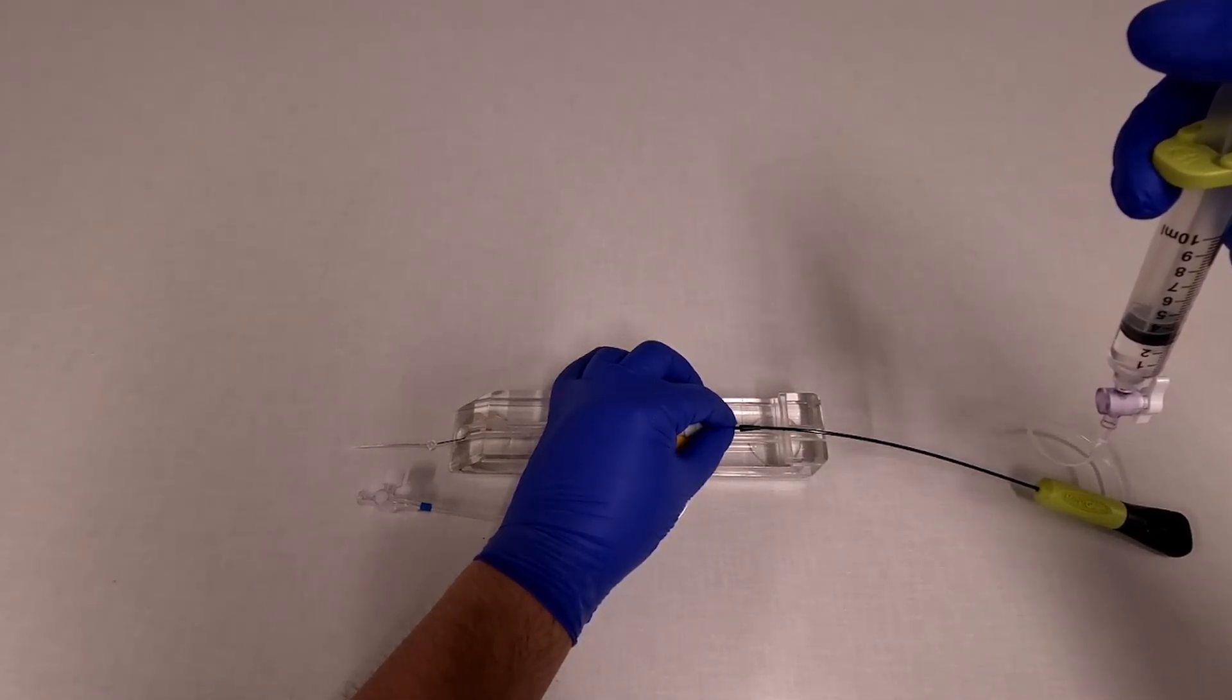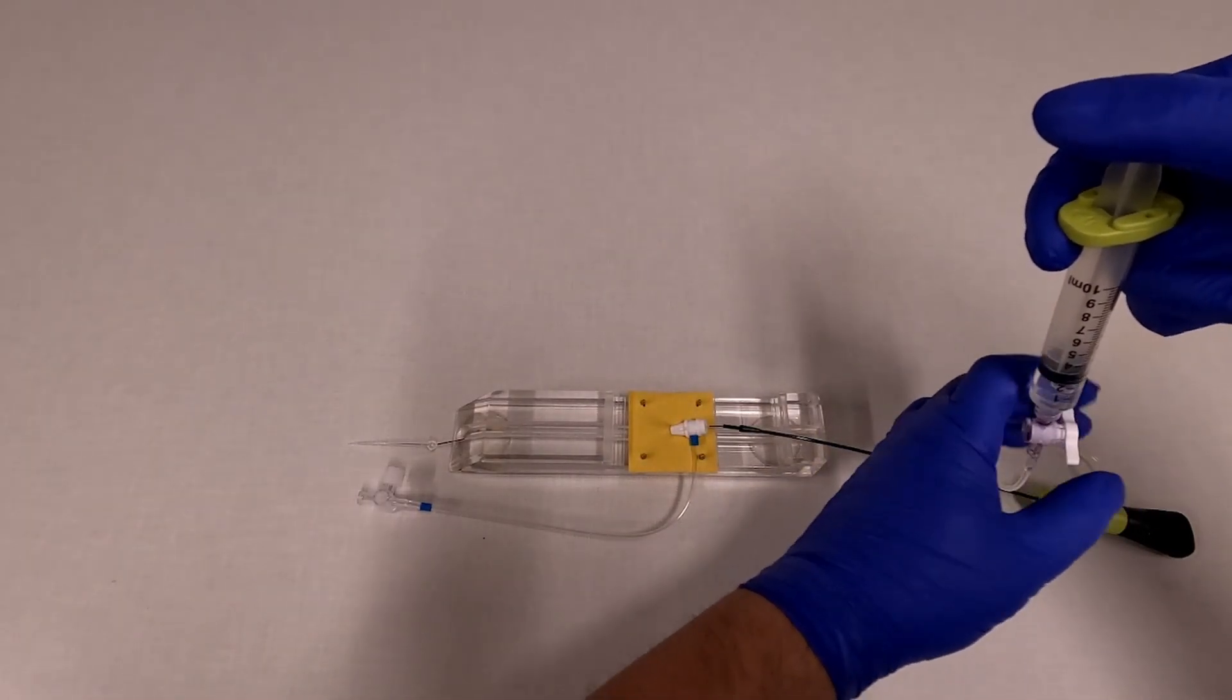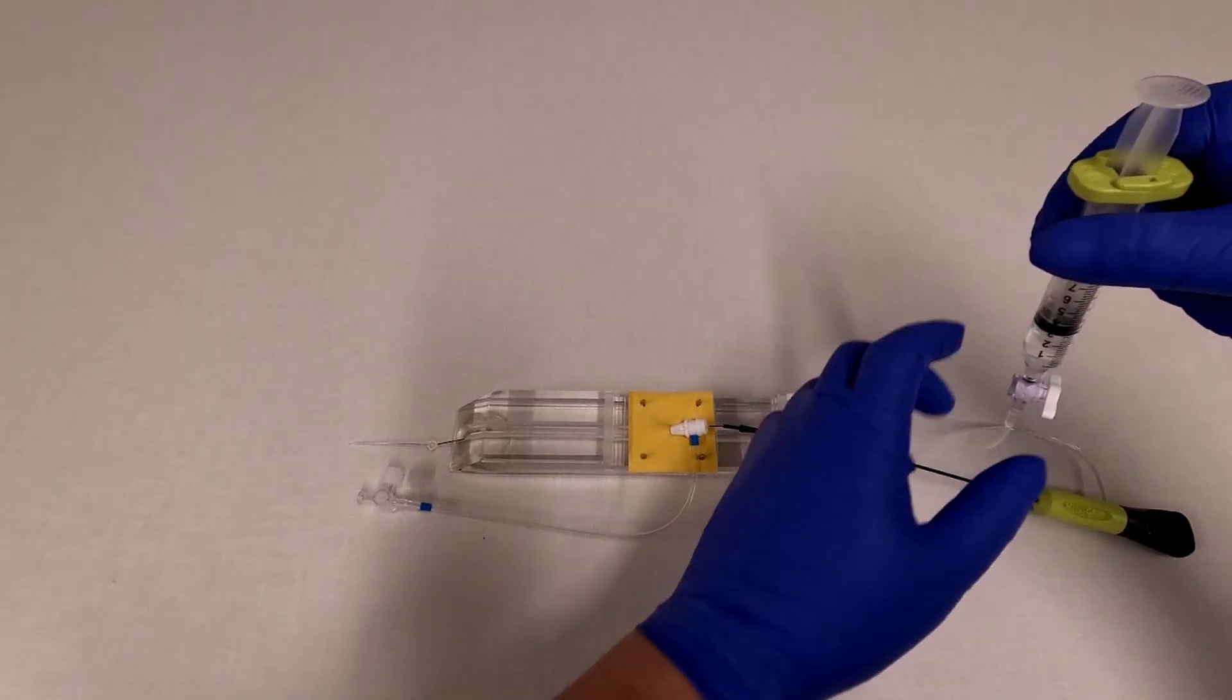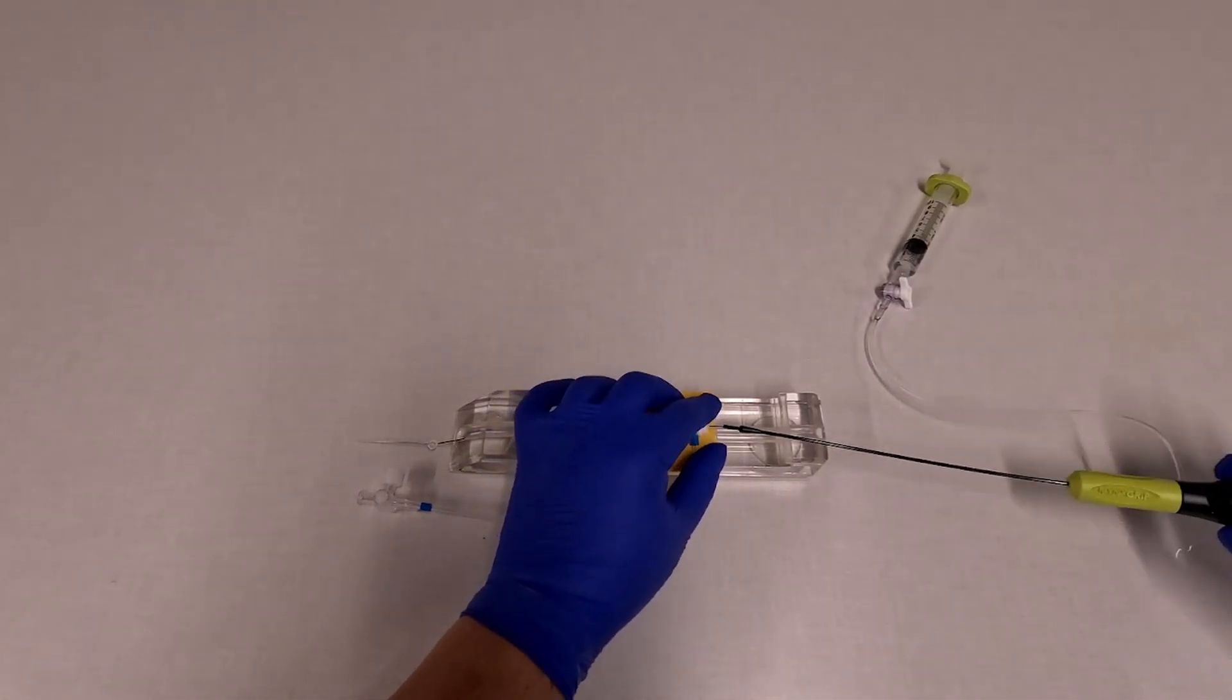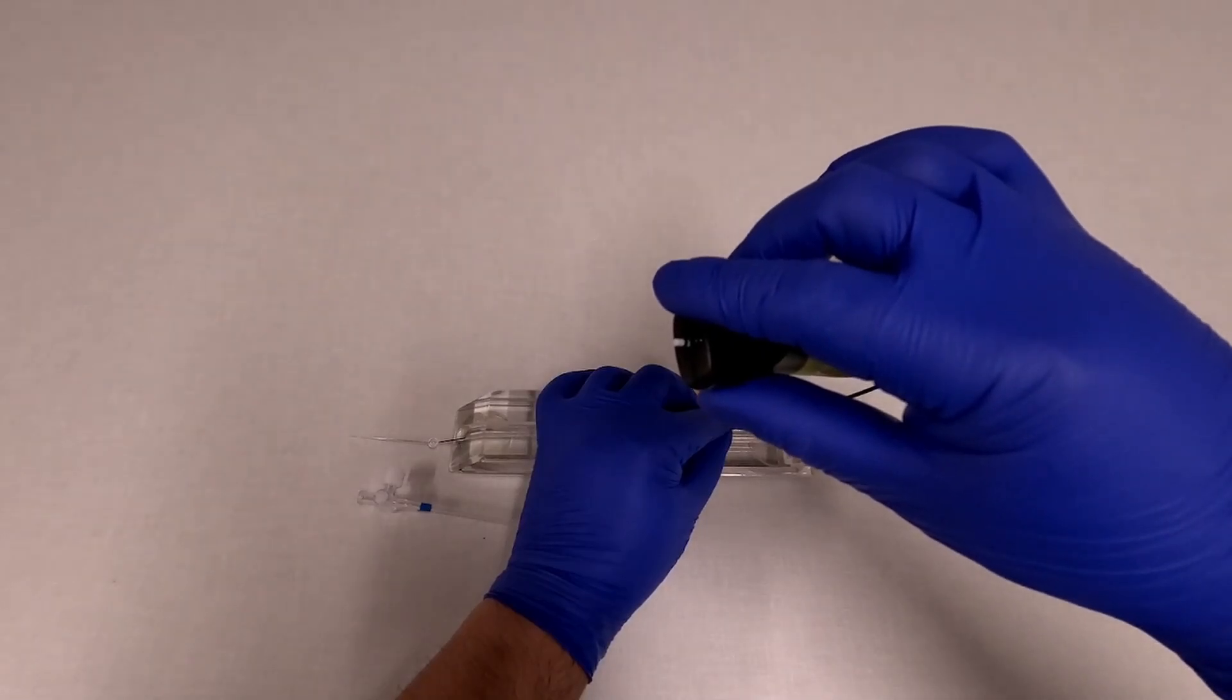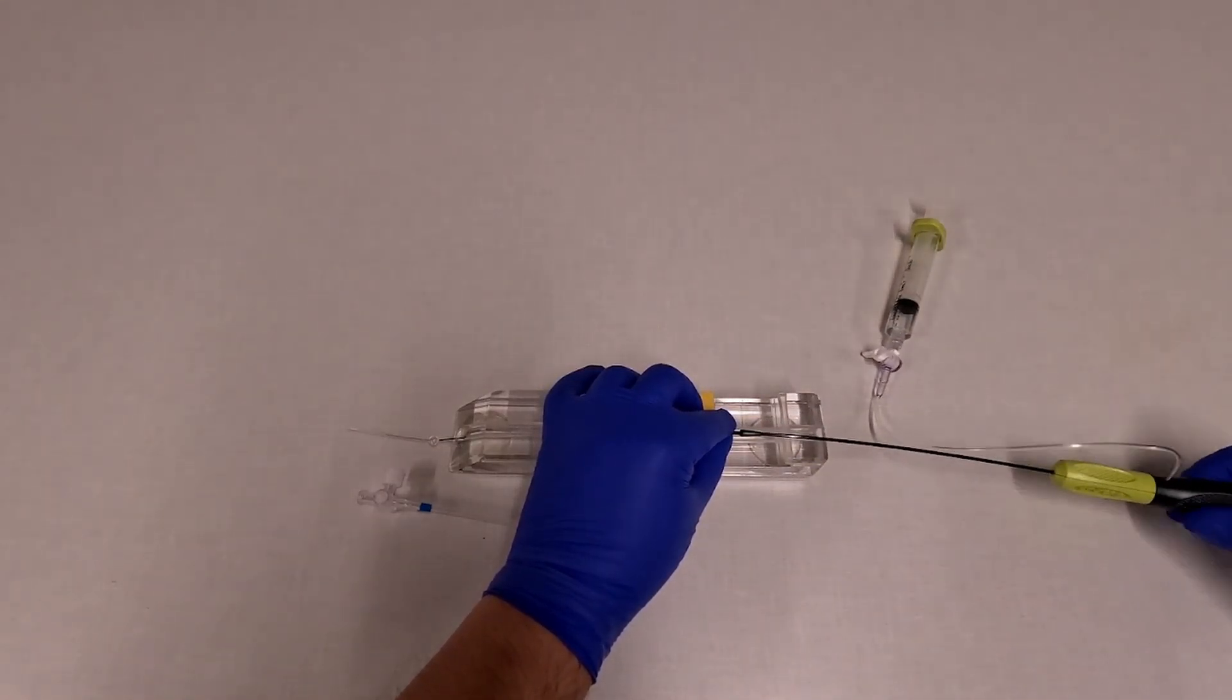So we're going to take our syringe and inflate. And then you can lock your stopcock. At this point, you'll see white, black, white at the back of the device as you see here. And this means that the balloon is inflated inside the lumen of the vessel.